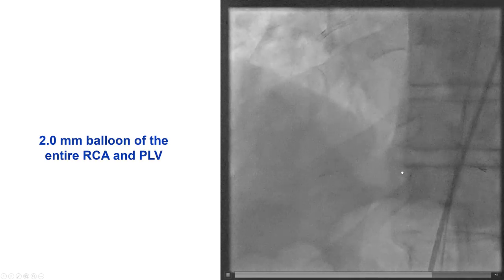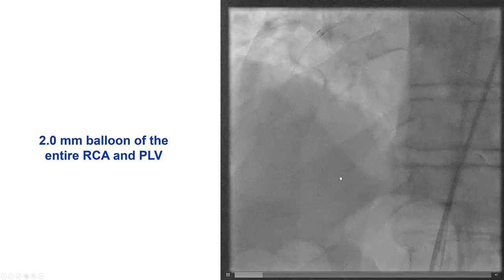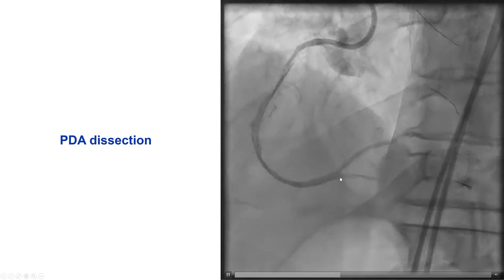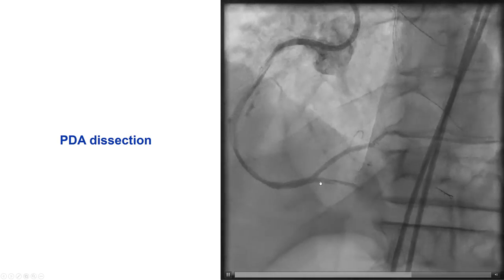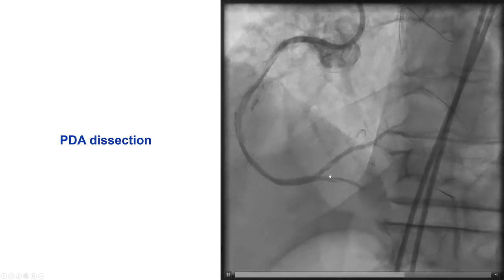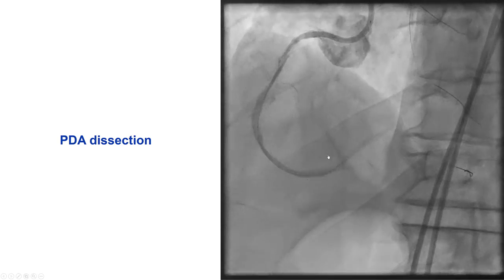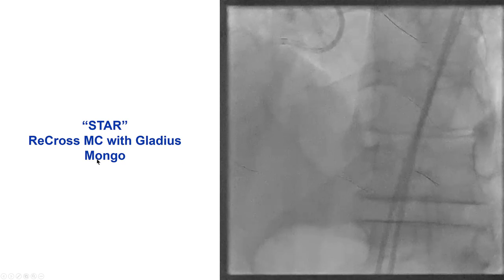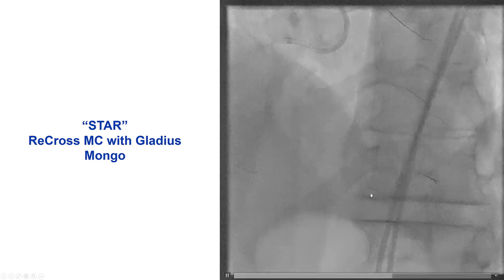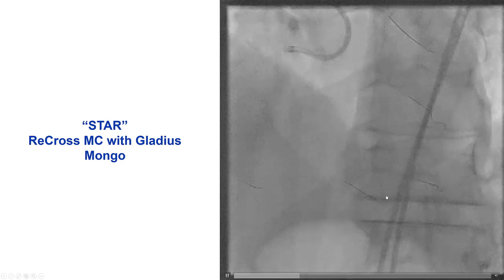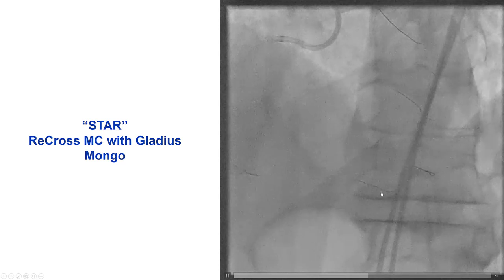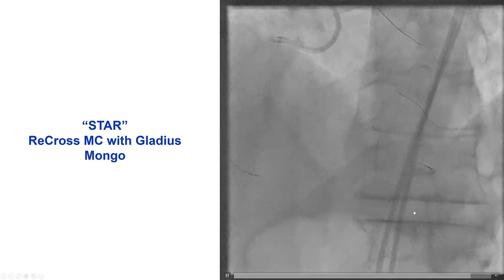At this point, we did balloon angioplasty of the entire right coronary artery into the right posterolateral, which did restore antegrade flow into the posterolateral, but there was some residual dissection into the PDA. We were in investment mode — making multiple attempts to get into the true lumen — but the re-entry point was unclear and likely too distal. To establish flow in the PDA, we used a polymer-jacketed wire and did the STAR technique, in which a knuckle wire is advanced distally until it actually enters the distal true lumen, which we know happens once the knuckle becomes smaller.